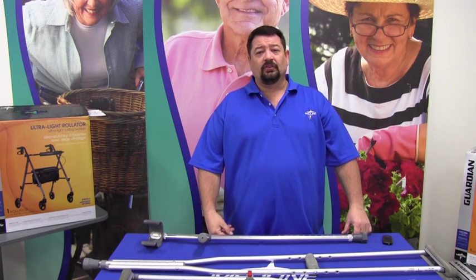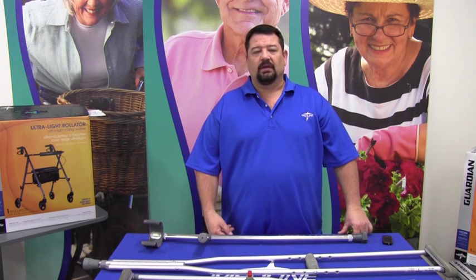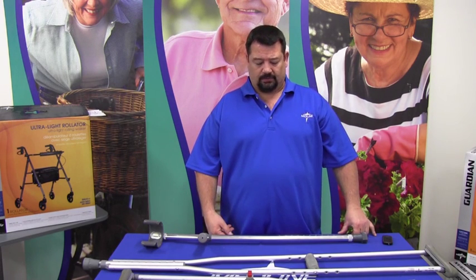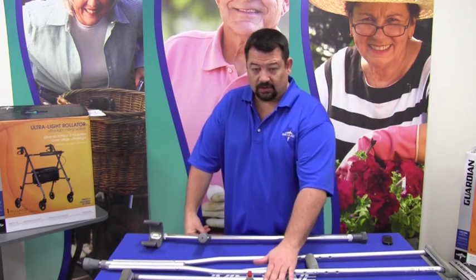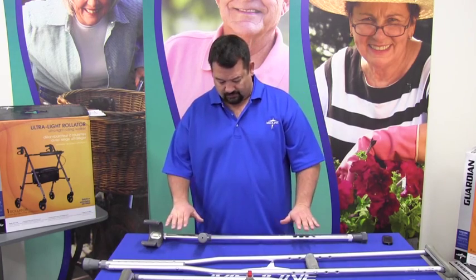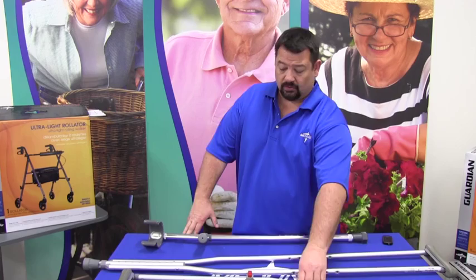Hi, this instruction is on crutches. Crutches are probably the most widely recognized piece of durable medical equipment there is. They come in several different versions. We have axillary crutches, we have forearm crutches, and then we have a variant on sizing of the two.